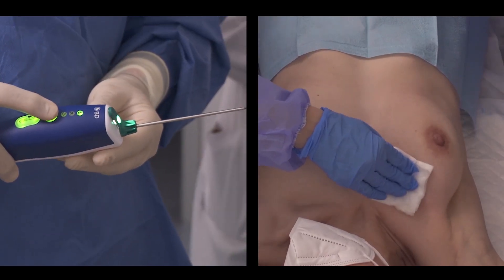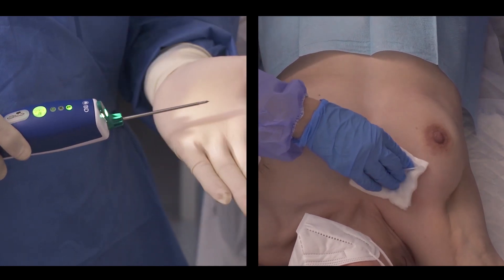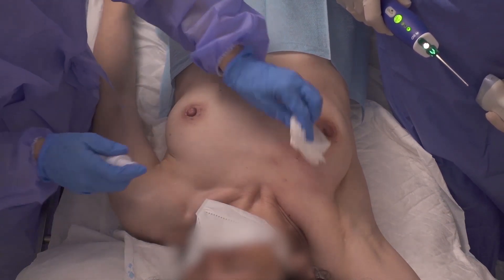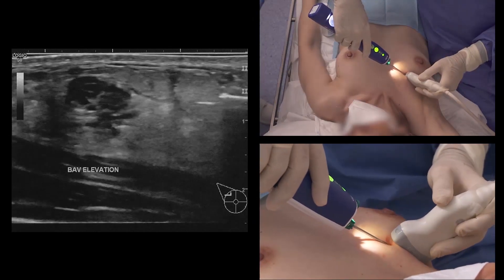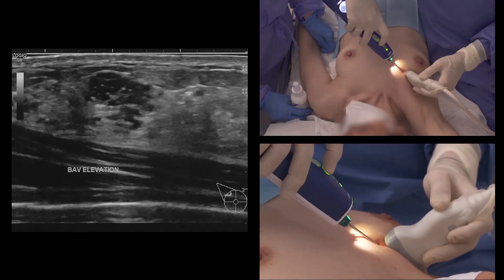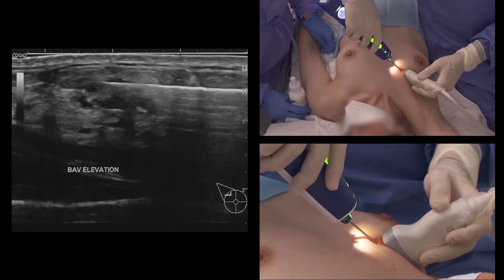The probe has already been attached to the driver. The prime pierce feature is used in this case since the area of interest would be difficult to pierce manually. Proceed with needle insertion to the pre-fire position. Fire the device when the needle tip is approaching the lesion. Stroke is 20 millimetres.